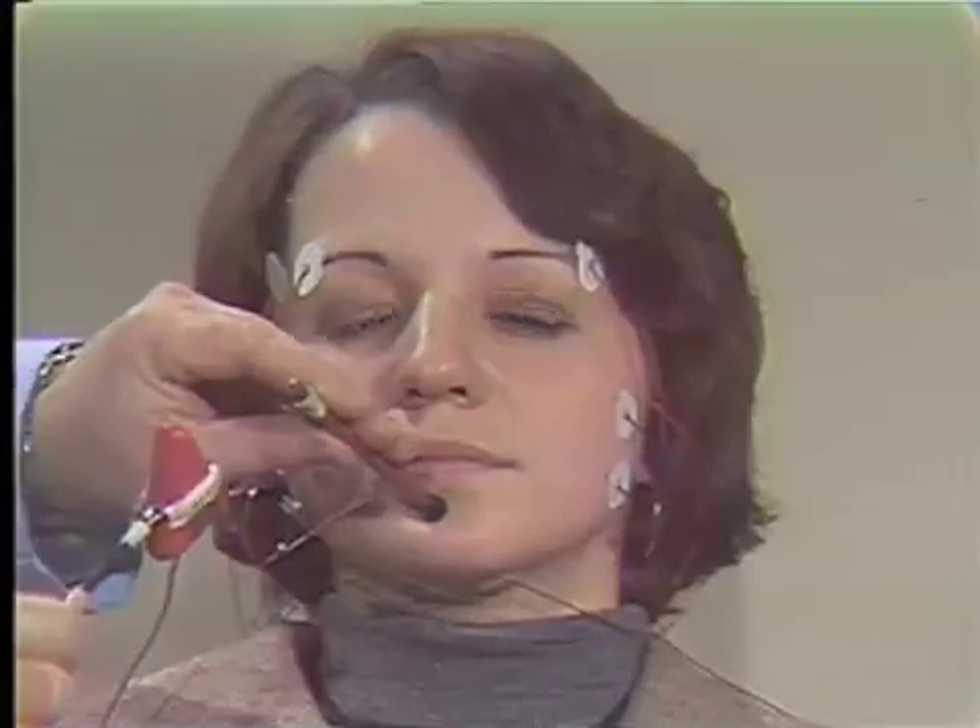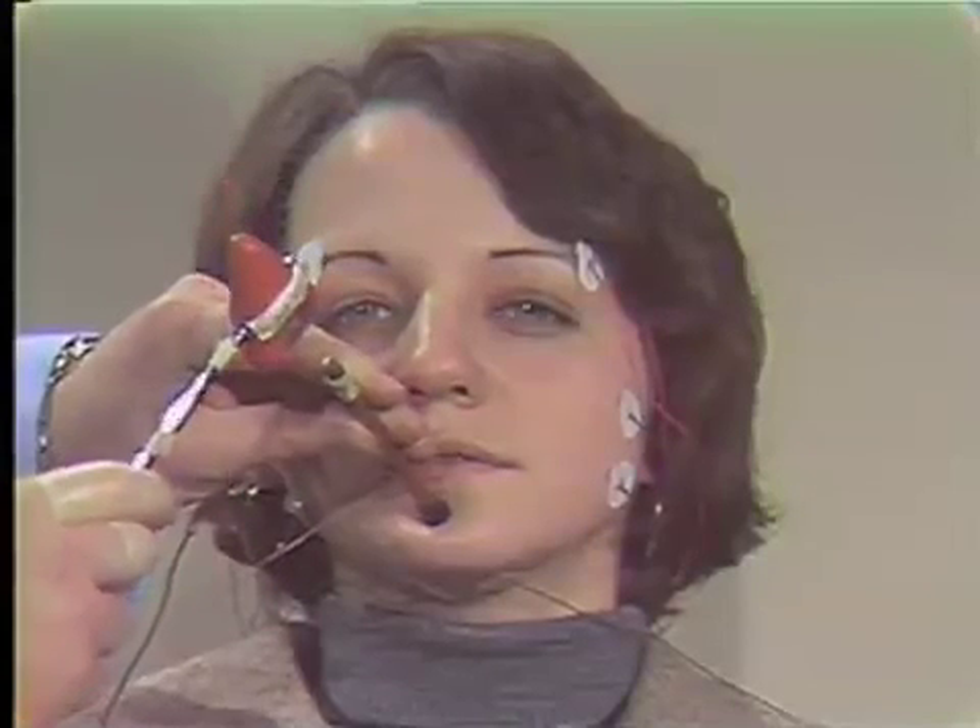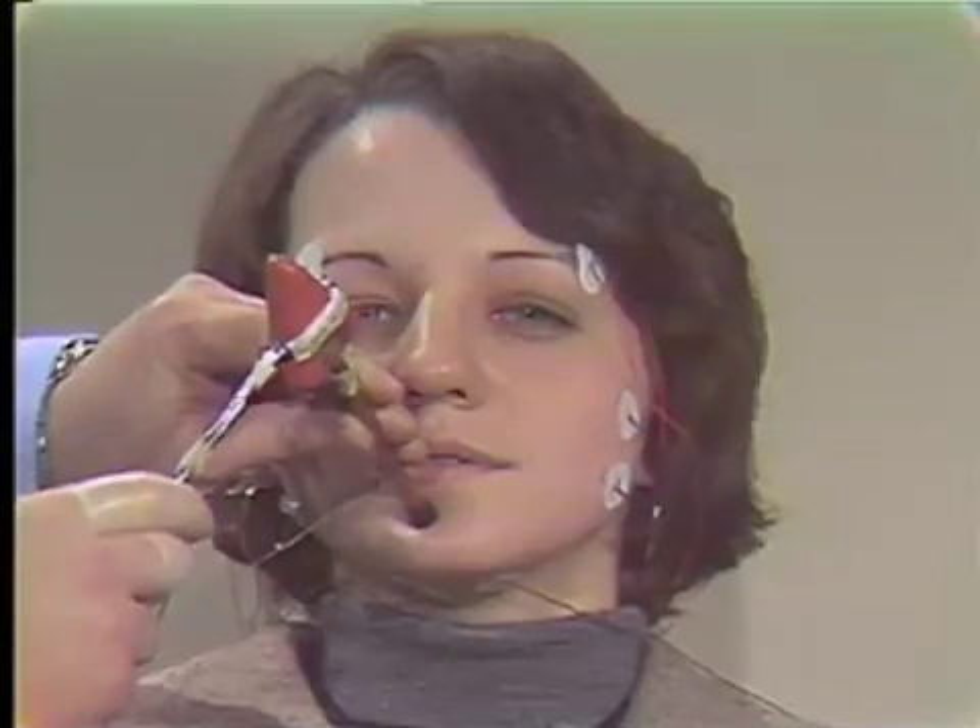This jaw jerk or unloading reflex — I'm going to produce this by first asking Karen to bite as tight as she can, and then I'm going to tap her jaw smartly with a hammer. We'll get Karen to bite a bit harder this time and do it again. Okay, now biting as hard as you can — ready, go. Can you see the reflex right in the center? That's the unloading reflex because it unloads the force between the teeth. And there's our silent period right in the center of the screen.